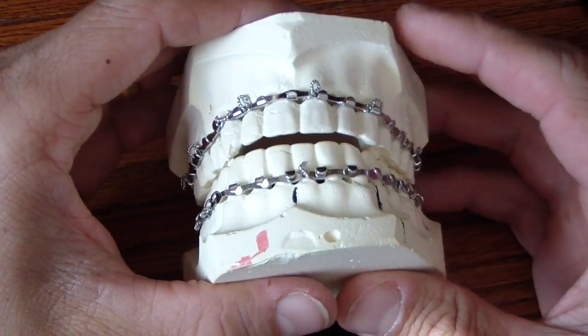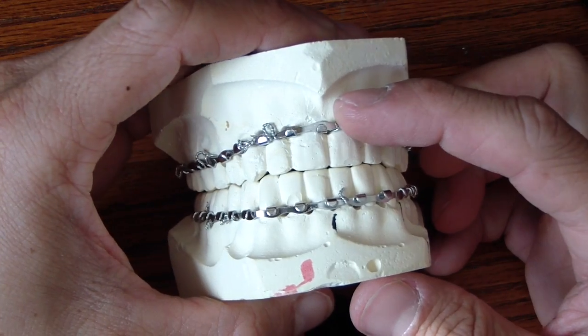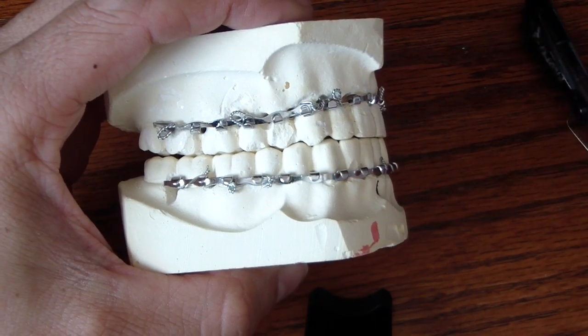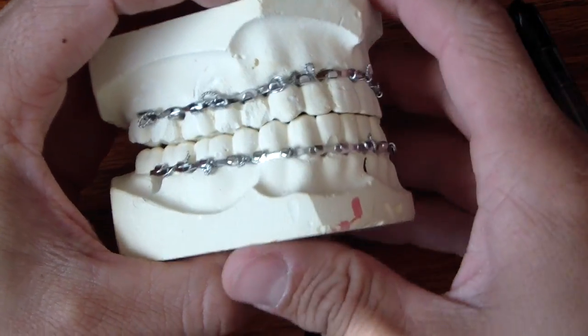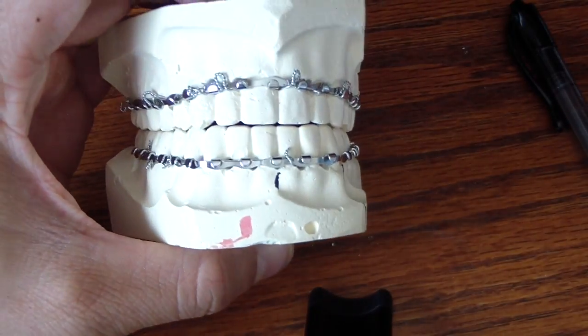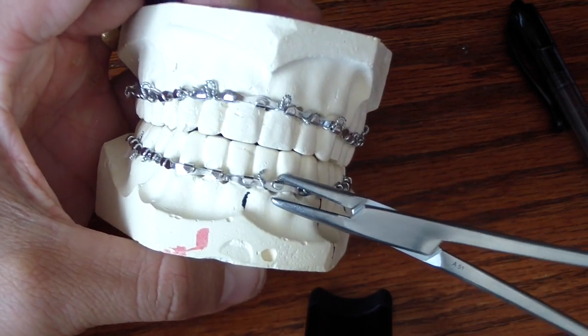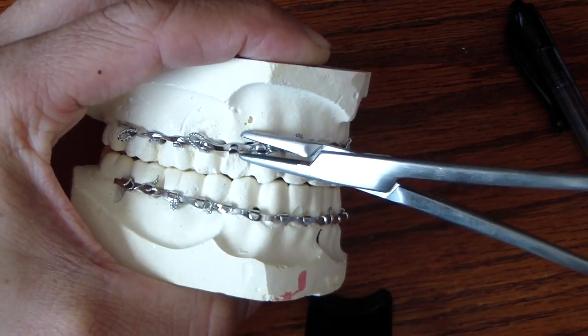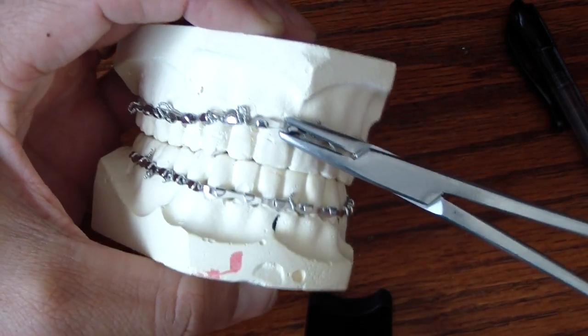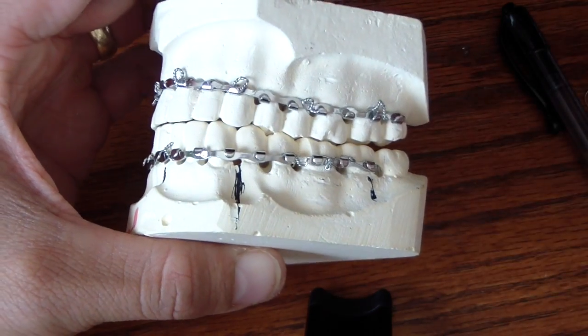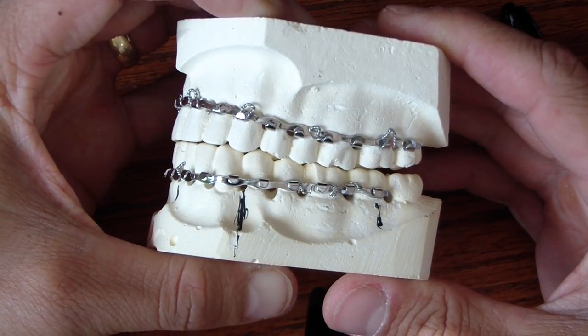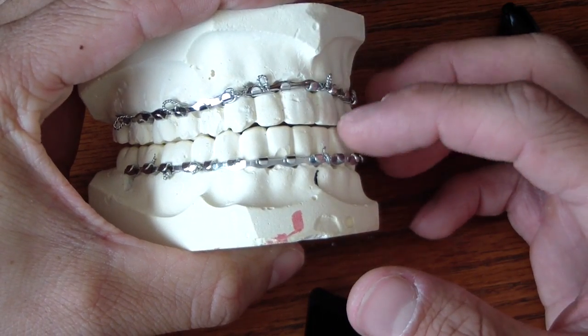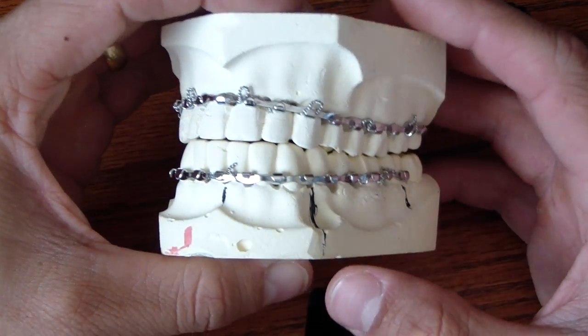We're using 26 gauge wire and one of the critical things is to make sure you're placing the lugs apically so when you go to use your fish loop to fixate the jaws and wire the jaws shut, it's not going to move. Make sure after you've placed your arch bar that it's not moving. You can do this under local anesthesia, commonly done under conscious sedation.